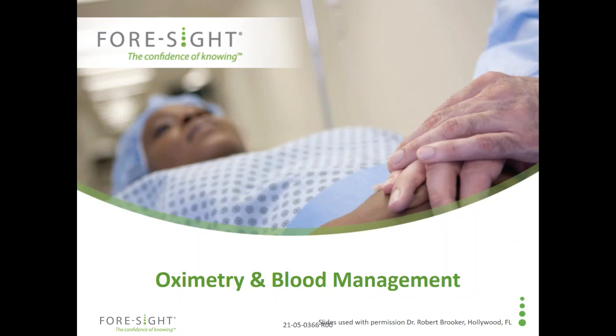So now that we've discussed the basis that we use the oximeter to help us with management of bypass in terms of cerebral perfusion pressure, cerebral blood flow, I'm going to talk a little bit about the oximeter and blood management, because ultimately, as again everybody here knows, an important component of oxygen delivery to the brain is oxygen content of the blood. And unfortunately, our patients here often present with issues that create anemia. And so a question we're always facing is the hemoglobin adequate, or is it low enough that we need to give blood?